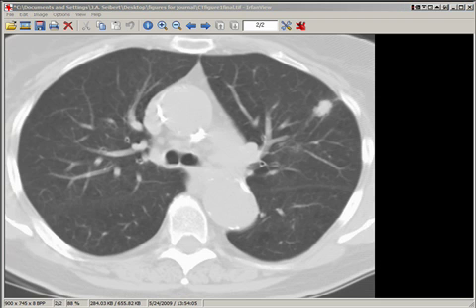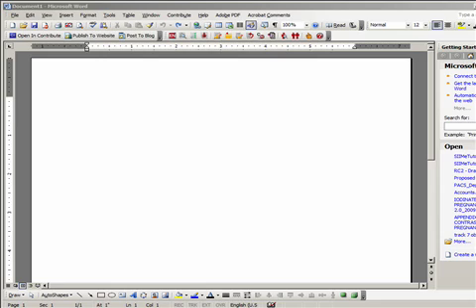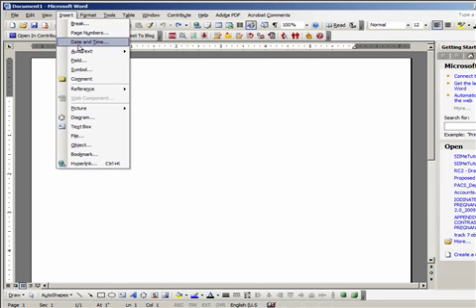We're done with the CT image figure. The verification step involves the use of a word processor to import the figure. For this example, Microsoft Word is used. Open a blank document as illustrated here.